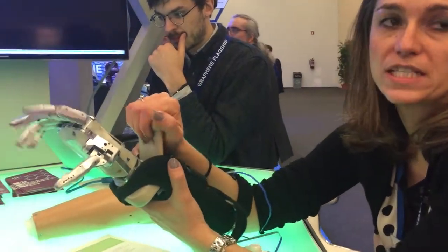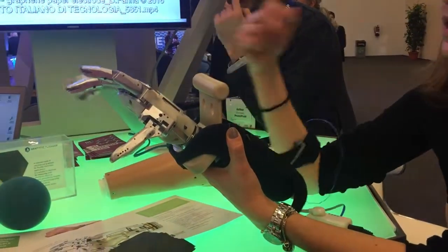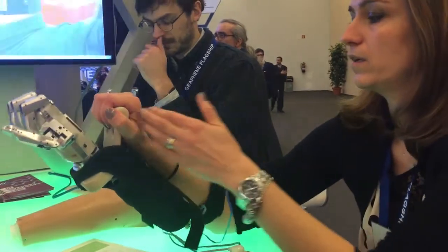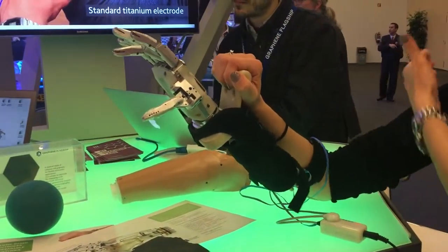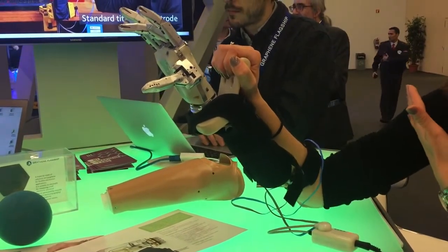Another important thing is that you can use other muscles with respect to these — for example, here in the shoulders — when the part of the arm missing is higher, for example when the patient is missing a bigger part of the arm.